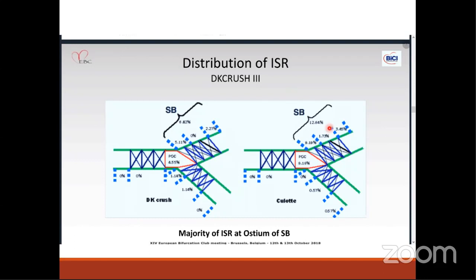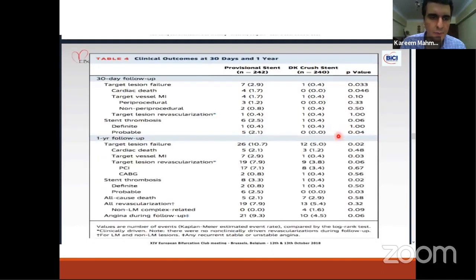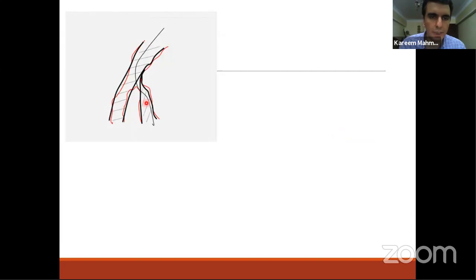So thank you, Mohammed. And I have here a comment also from Dr. Ahmed Samir regarding the wiring of the side branch stent. And again, we recommend the proximal position of the recrossing. As we see here, if we achieve a proximal position of the rewiring, we can ensure that we have our stent inflated and we avoid such a silly complication in the side branch.